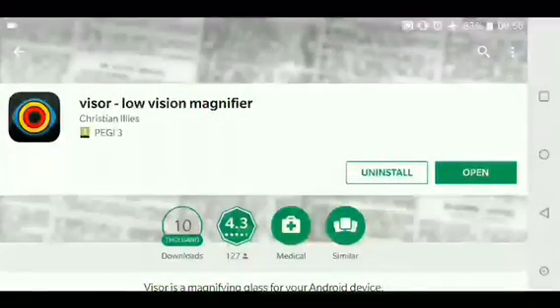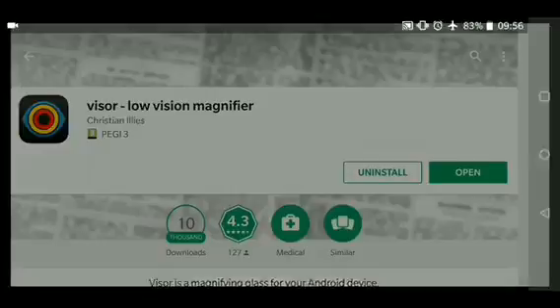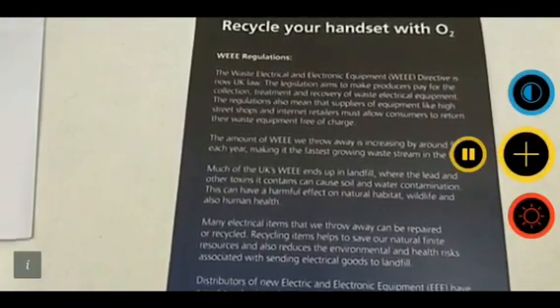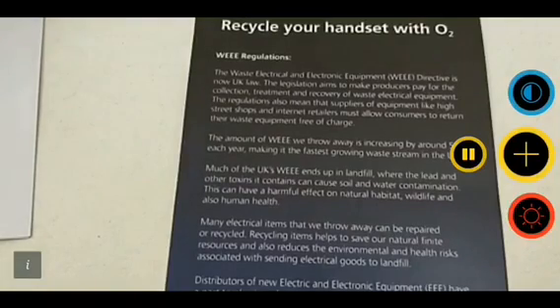So this is the app — Visor Low Vision Magnifier. It's free to download from the Play Store, so a free app, can't go wrong with that at all. So let's open it up and show you how it works. It's a very simple app, there's nothing too much to it, but what it can do is fantastic.